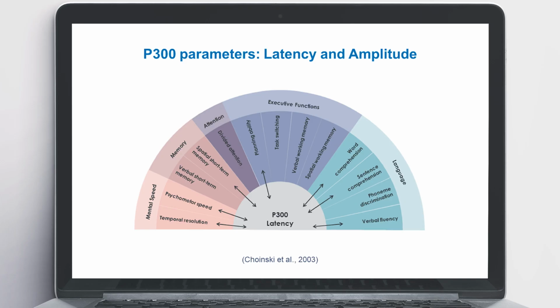Because neural processes are inhibited, all unwanted extraneous processes are slowed down, allowing one to focus more clearly on the task at hand. P300 amplitude correlates to the number of neurons engaged during the cognitive task, while peak latency indicates the speed of event processing, the speed of categorization of a significant stimulus selection. The shorter the peak latency is, the faster the participant completes the task.